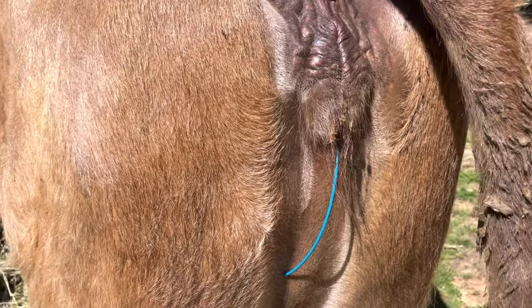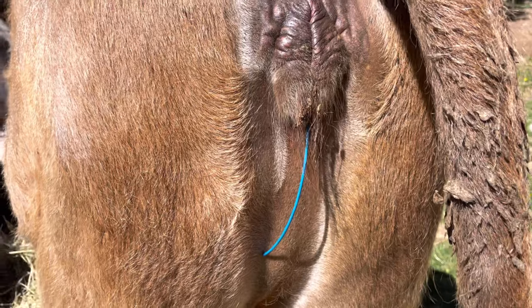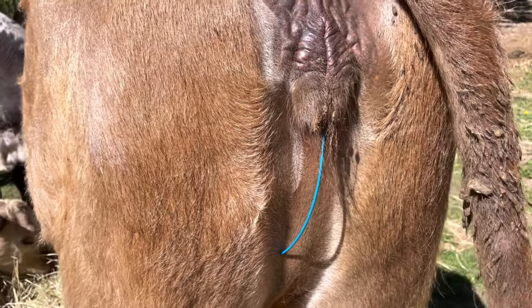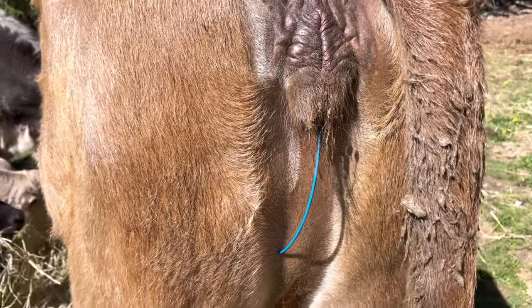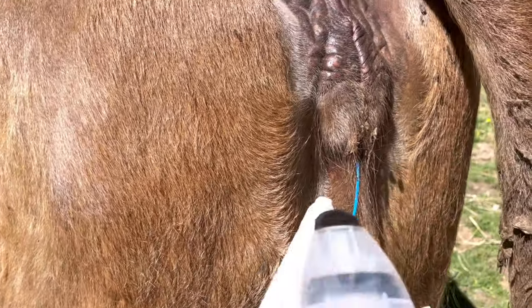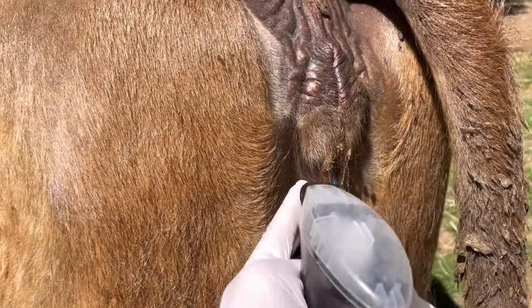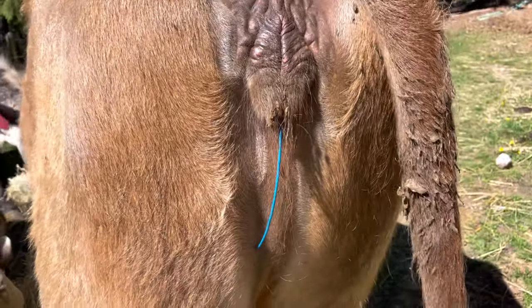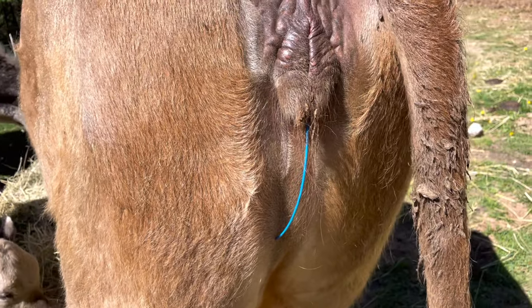Here's what it looks like on Honey. You can see that the tail is sticking down, and that's what we'll be using to remove it when the time comes. You can understand that if it was sticking up and out, the cows would nibble on it. But this stays nice and flush with their body and the cows don't typically bother it on each other.